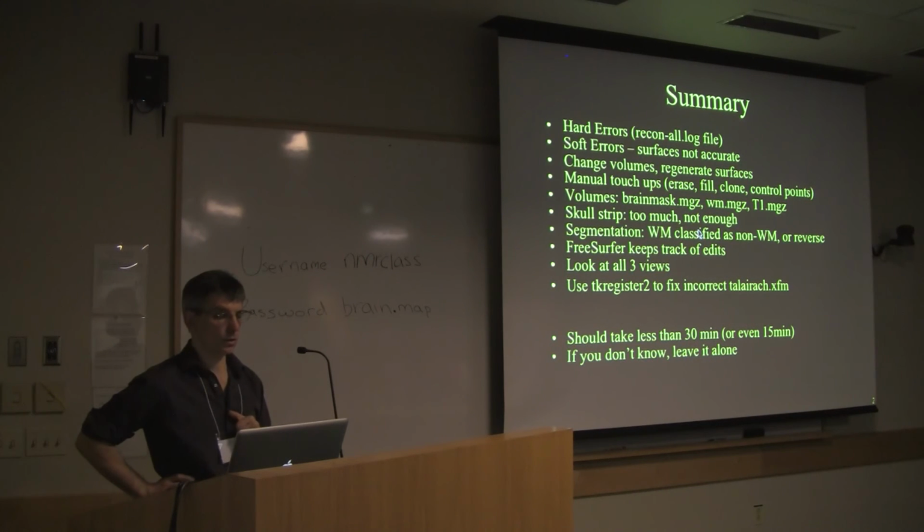And make sure to look at all 3 views when you're looking at these surfaces and trying to judge whether they're accurate or not. Look at all 3 of the views before you make a final decision, and certainly before you start taking corrective action. And again, this should take less than 30 minutes per subject. Oftentimes for us, less than 15 minutes. And if you don't know, just leave it alone, and it'll be fine.